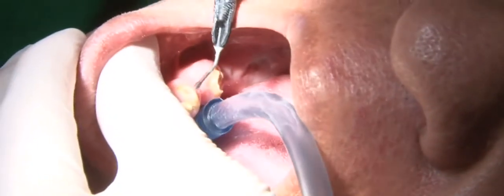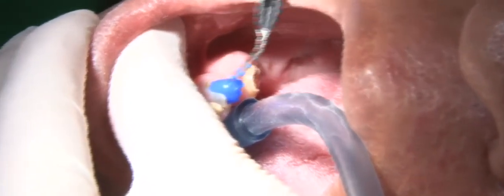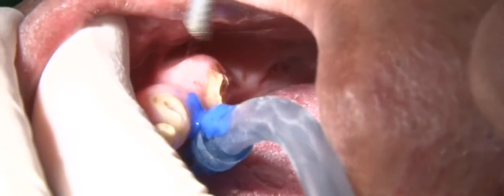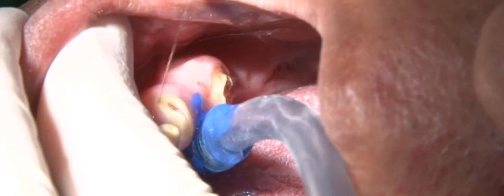The post space and the tooth are etched with 37% phosphoric acid. The etchant is placed for 10 seconds and then rinsed. Etch helps in removing the smear layer formation in the canal space along with any debris. After copious irrigation, the canal space is dried using paper points.